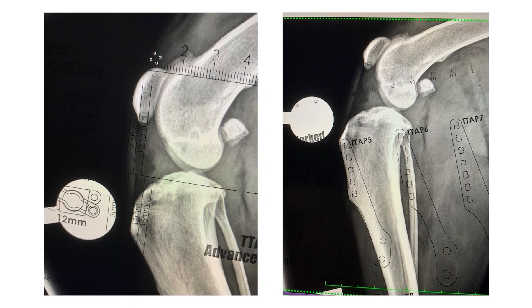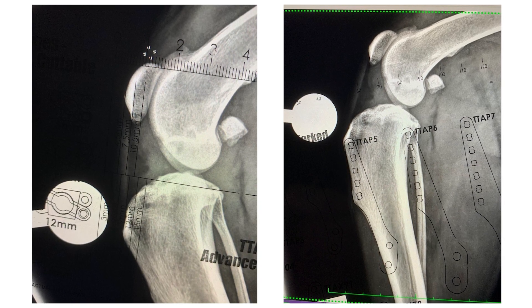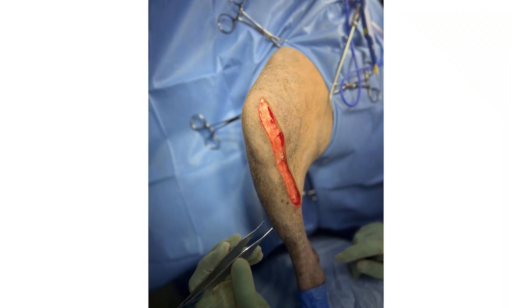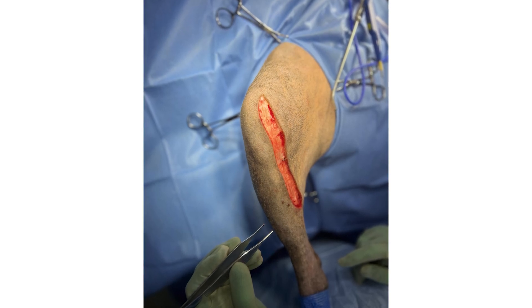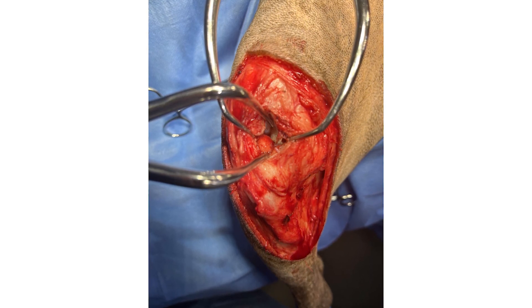Very accurate preoperative planning is essential both to ensure correct positioning of the osteotomy and to determine the degree of advancement required. The patient is positioned in dorsal recumbency and the stifle joint is approached via a medial incision. A mini-medial arthrotomy or arthroscopy should be performed in order to inspect the joint space.